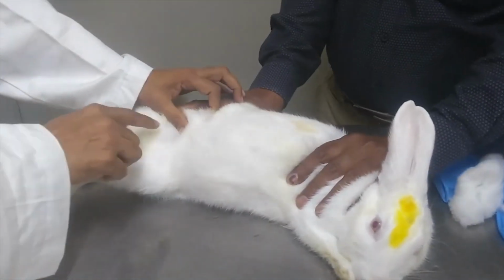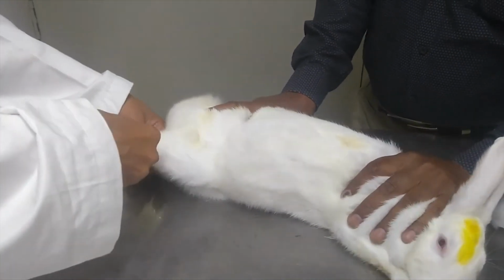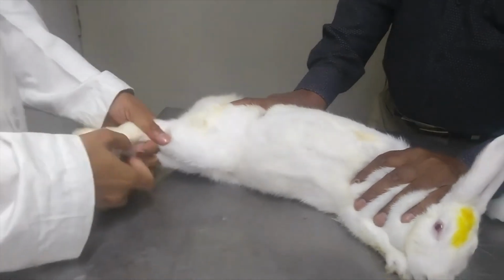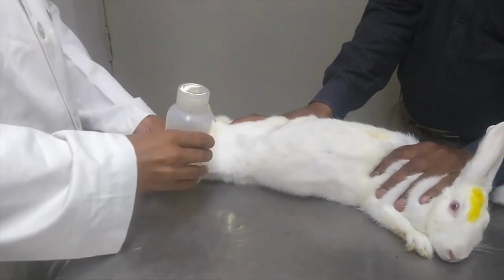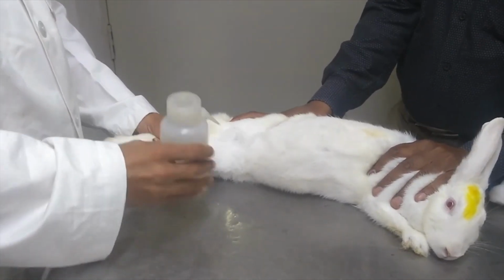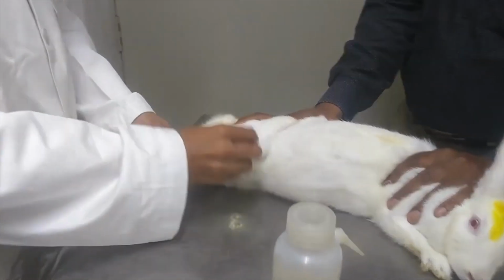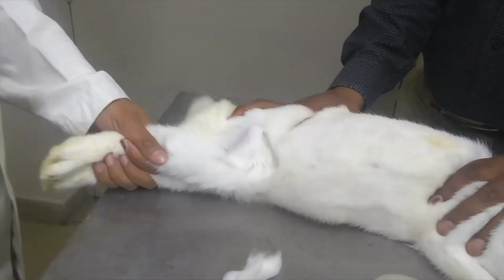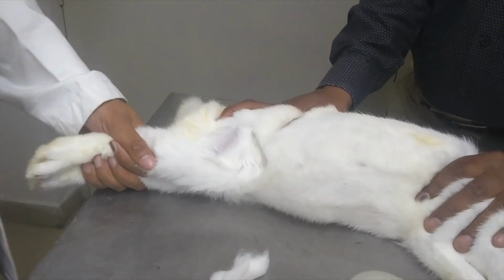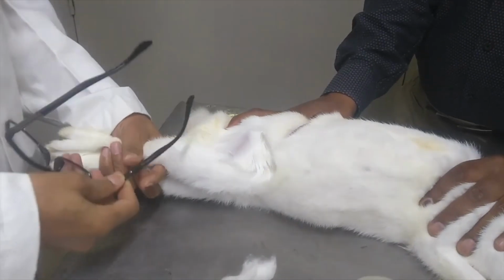We'll inject the emulsion into the thigh. We have to catch hold of both the legs. Then we have to sterilize the area using alcohol. We have to look at the thigh muscles. They should be cleanly visible. Skin should be cleanly visible.